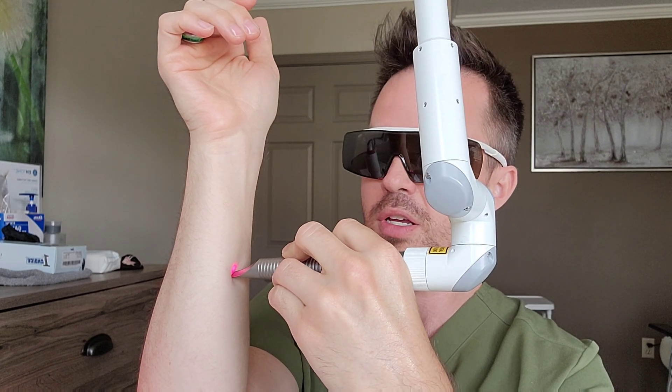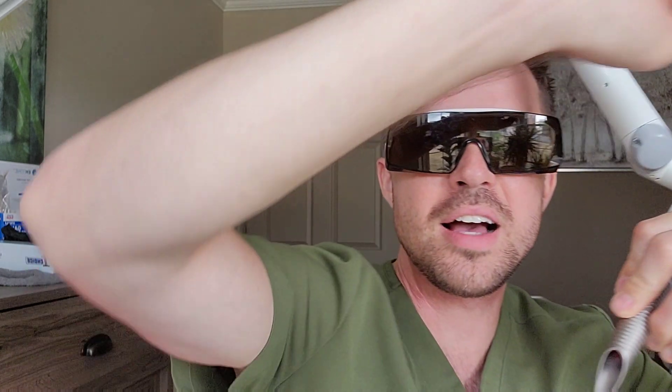You'll see from the red light what that looks like — looks like a full circle. I can demonstrate this right here on my forearm. Can you see that little white mark right there? Let me move that in nice and close. It's pretty subtle but you can see it there. I passed the full beam through that whole red bit laser shot and hit that whole surface, so those upper skin cells were vaporized and also a little desiccated. That's where they're white.